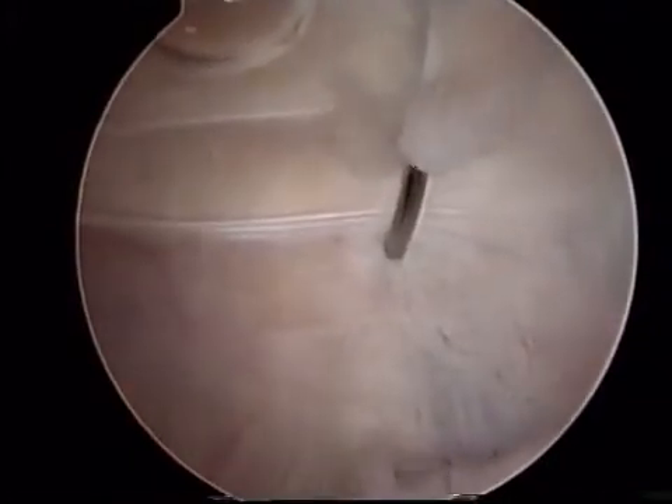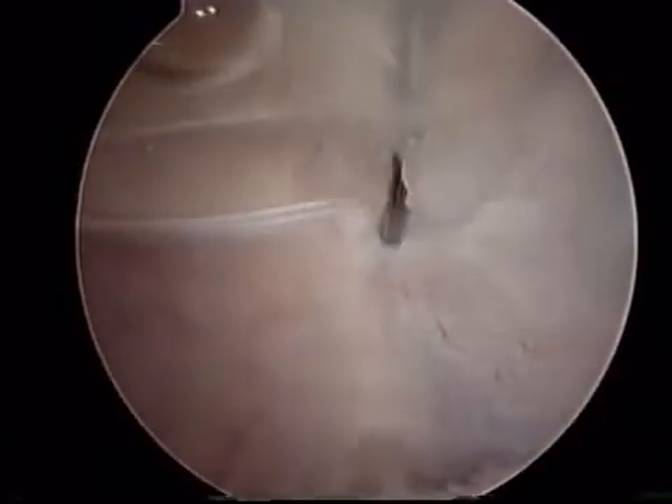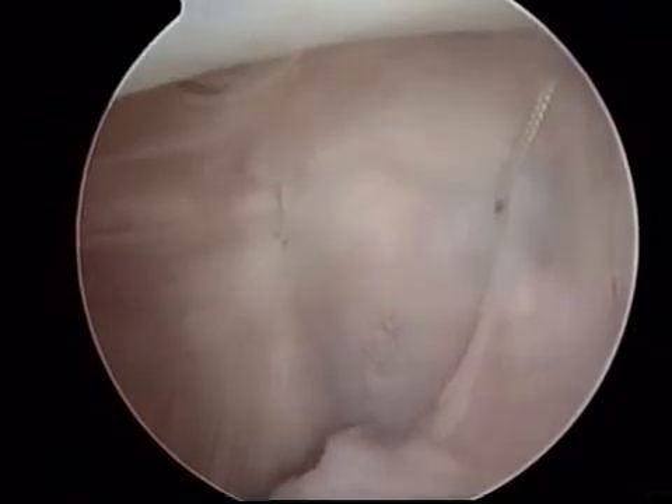This, again, is beneficial in that we only need to make a small incision on the outside of the knee to retrieve the sutures and tie them down tightly. In this particular instance, we have decided to place three sutures.